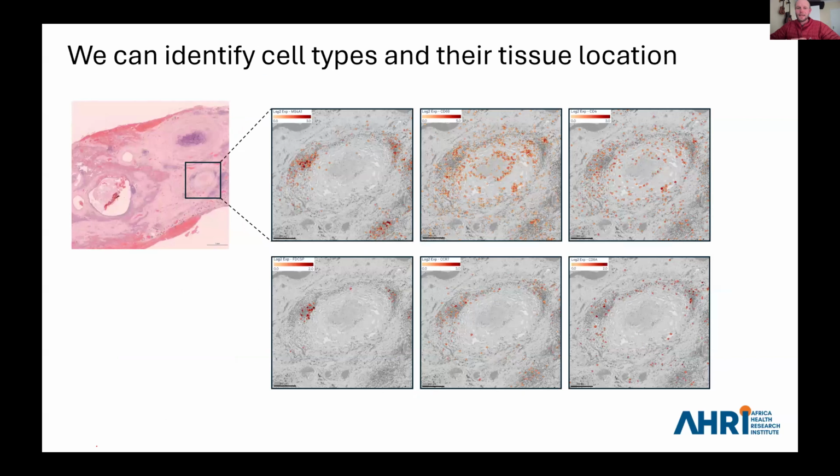And then just going back to the TB sample slide, so this is the single cell resolution. It obviously allows for looking at just individual cell markers. So I'm interested in B cells. Just homing in on this particular granuloma within the lung tissue sample, we can look at expression of different cell markers.